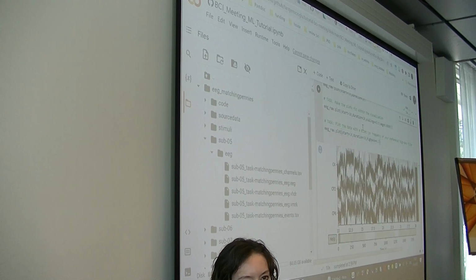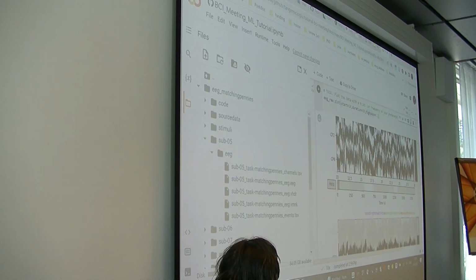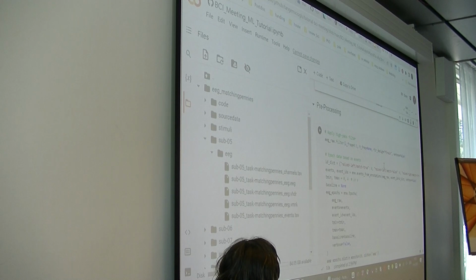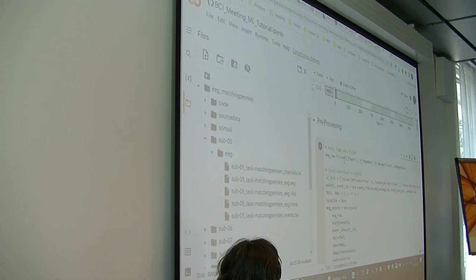You can continue playing with these if you would like, but we will move on to some of the pre-processing. Now that we have the high pass filter visualized, if we like it, we can apply it. Behind the scenes, this one is a SciPy function if you used that one before, but MNE again has their own way of implementing it to work with their own data format.